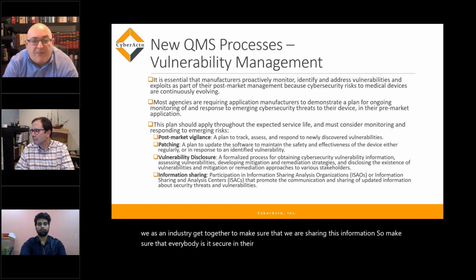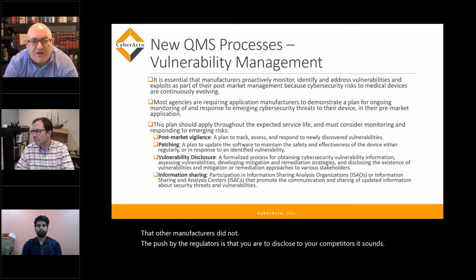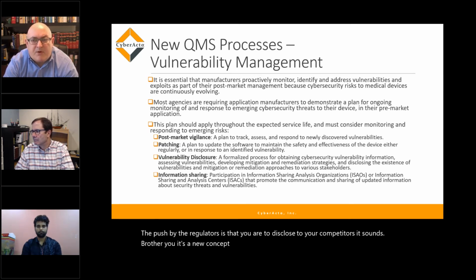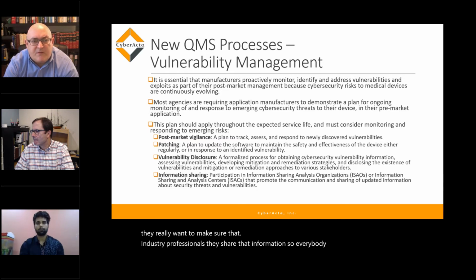So if we found something in a particular system, let's say an operating system, that other manufacturers did not, the push by the regulators is that you are to disclose that to your competitors. It's a new concept, but ultimately it pertains to the safety of a patient or a user. So they really want industry professionals to share that information so everybody can take the steps associated with that security.